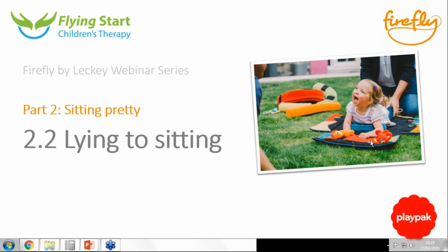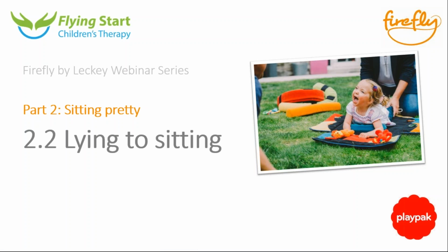So as I say, work on the two bits: work on the independent sitting if you can, if that's what your therapist has advised, but then also work on the more supportive, almost working on your upper limb stuff, so working on bringing those hands forward as opposed to the sitting, if that makes sense. Has that answered the question? I think so. It makes sense to me.